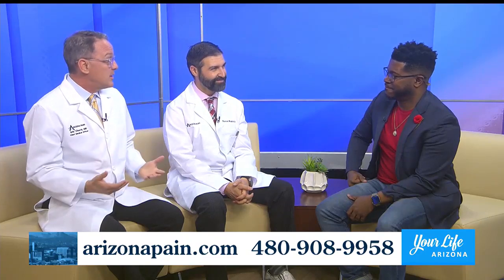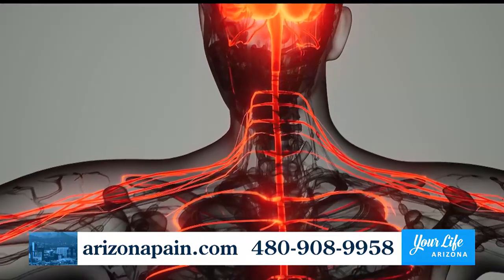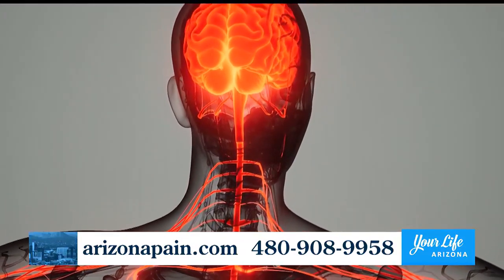And how does a peripheral stimulator work? Well, nerves, when they get damaged, they can cause pain. They can cause burning, numbness. And nerves are like electrical signals that send signals to the brain. But when the nerves are damaged, they'll send abnormal signals to the brain. Kind of like the old TVs with the rabbit ears. If the rabbit ears were moved a little bit, or they were damaged, what do we see on the TV? We saw static. So when your nerves are damaged, they're sending static to your brain. So what we want to do is decrease the static to your brain, so your brain doesn't see the static and you get relief from that.